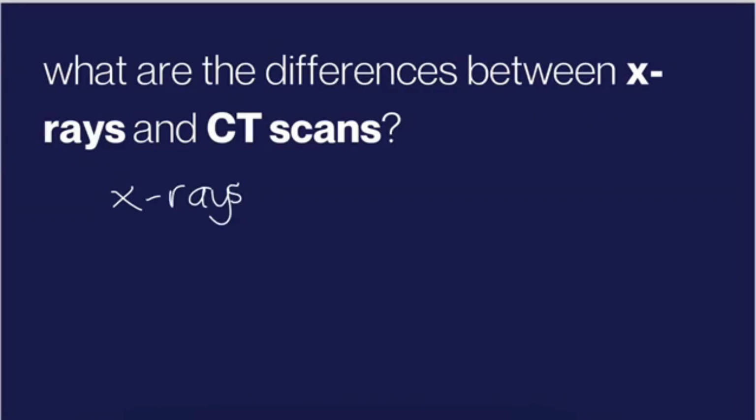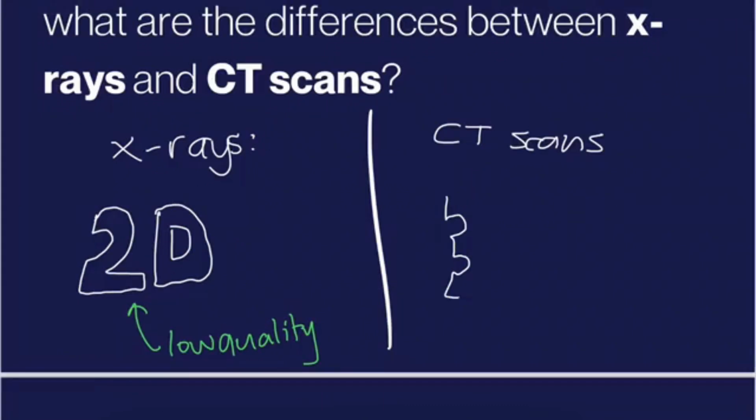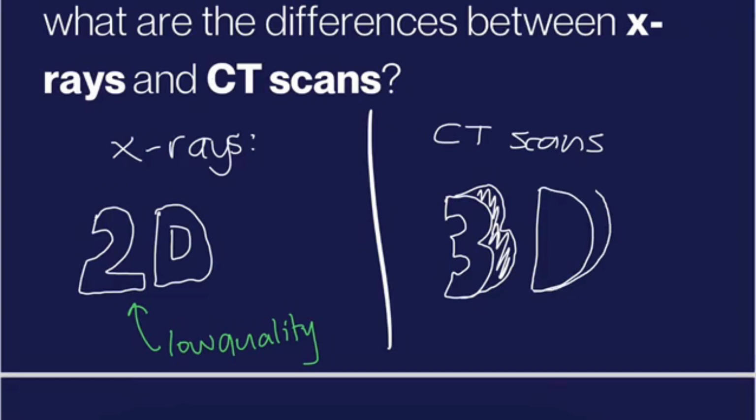When comparing X-rays and CT scans, there is one fundamental difference. X-rays are only able to image the body from one set fixed point. This is only useful to a degree, which is where CT scans are great for. CT scans are able to create three-dimensional images of the body, increasing the detail and clarity for doctors and technicians in aiding in better diagnosis.